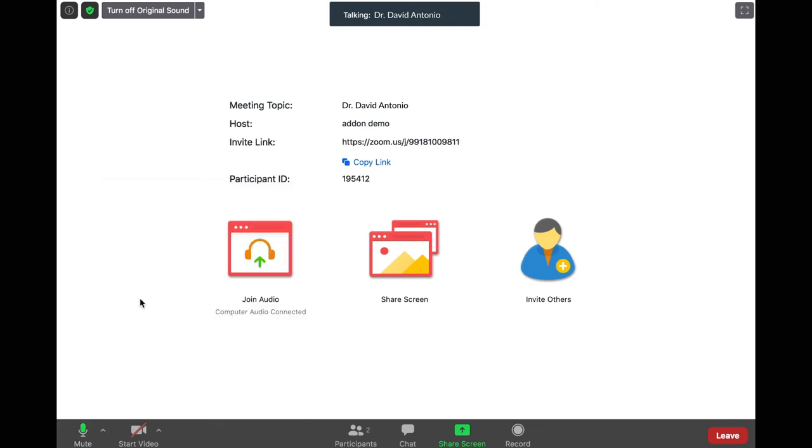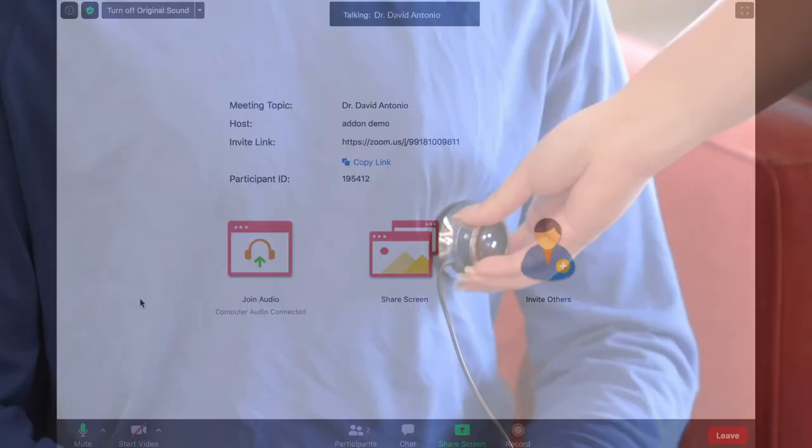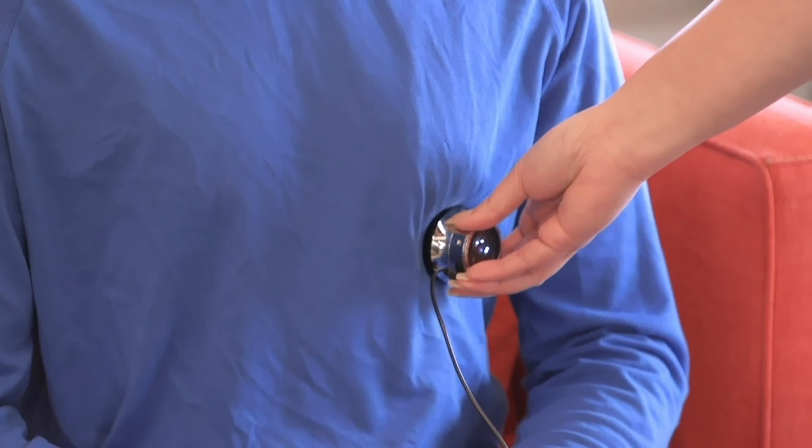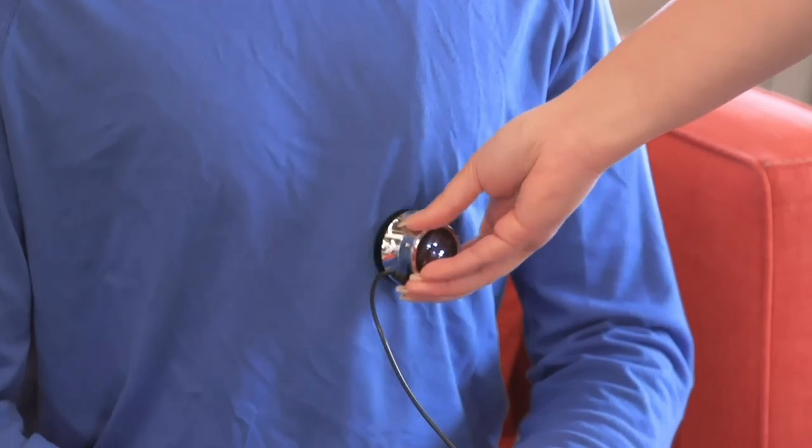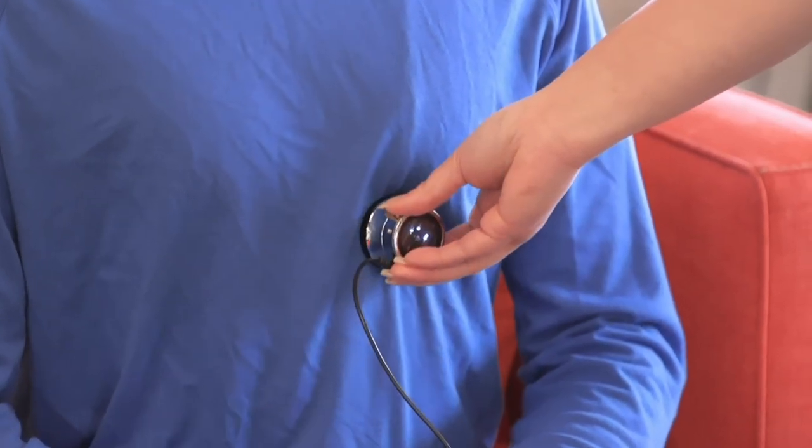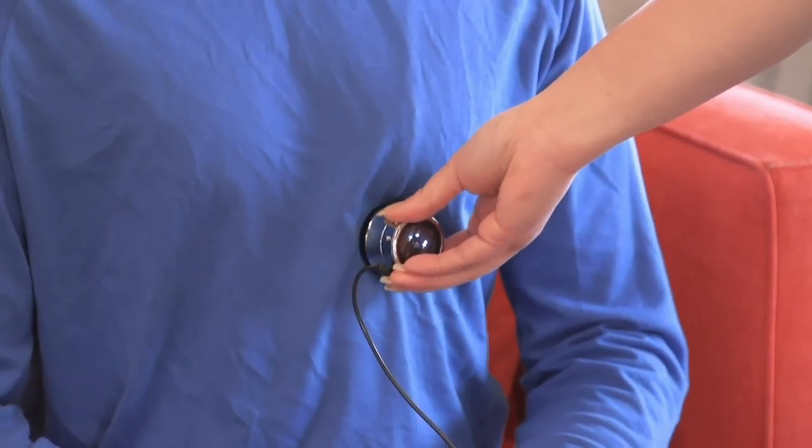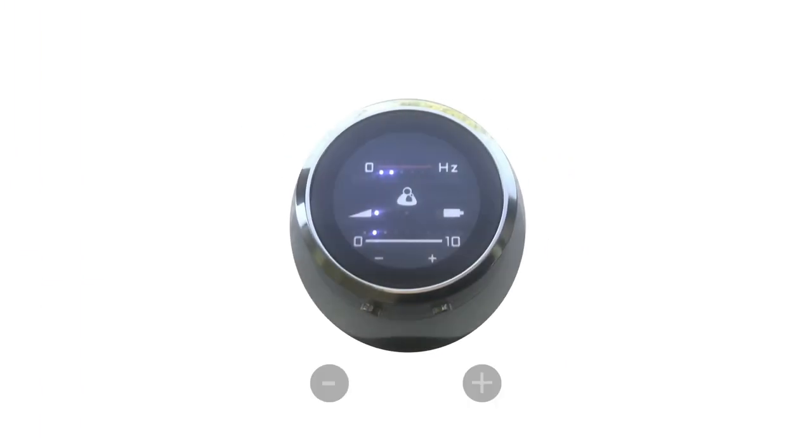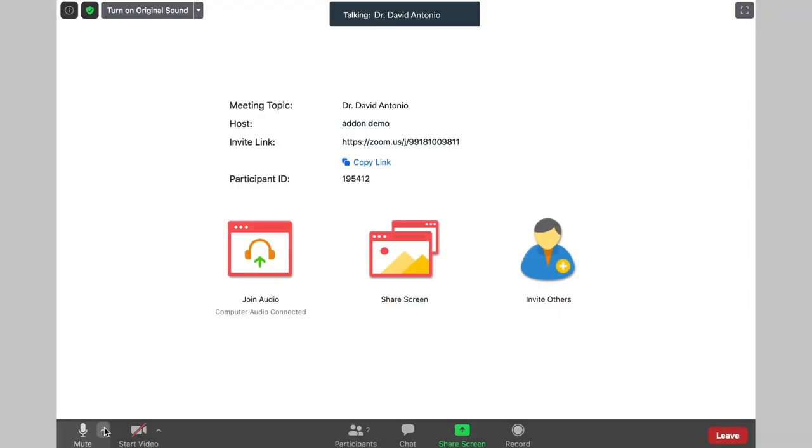Put on the earphones plugged into the USB connector to listen to your provider's instructions. Note that you cannot talk to your provider during this period. Place your stethoscope as instructed by your doctor and your breath and heart sounds will be transmitted to them through Zoom. You can use the buttons at the bottom of the stethoscope to increase or decrease the volume.